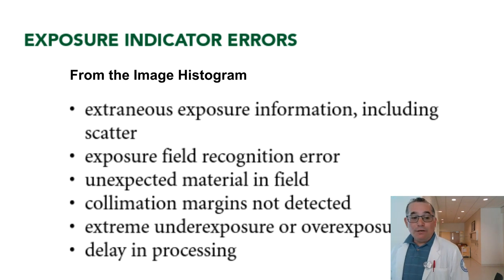Or if you take too long to process, so I skip from the top down to the bottom. If there's a delay in processing, that's what Jody Ann was doing. We had a lab within the lab last week. We wanted to see what happened when you, one, opened up the cassette and exposed it to light briefly, 2, waited 3 days to process, and 4, waited a whole week to process, which would have been this morning. I'm looking forward to seeing what the results of that are. But those will certainly throw off the exposure indicators if they don't erase the image completely.